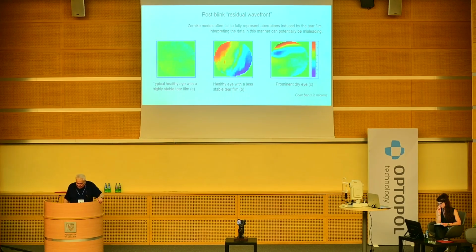It's called residual wavefront. If you work with the wavefront, you know that to get the wavefront, you do some approximation, or interpolation, but normally it is approximation with Zernike polynomials or Fourier polynomials, or for example, Zernike-like, some more complicated polynomials. It doesn't matter.